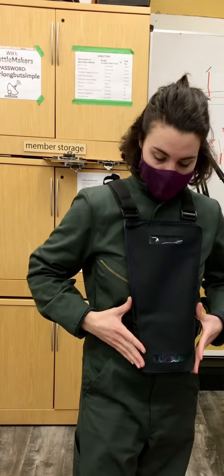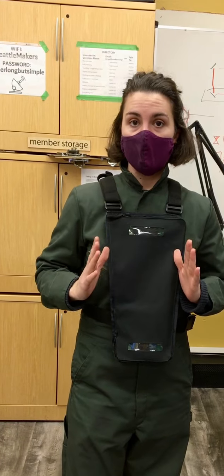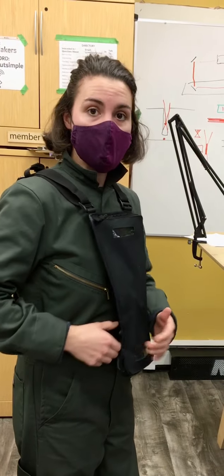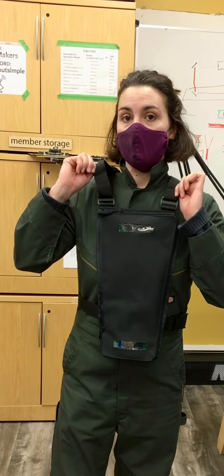We have a stiff front panel to keep the sensors well oriented and to prevent noise and shaking from distorting the images, as well as a couple different belt loops to make this more adjustable. And you also have your adjustments up top here with the straps.